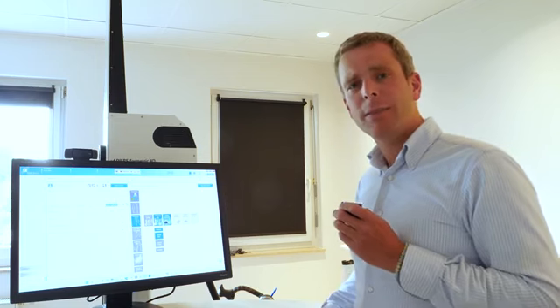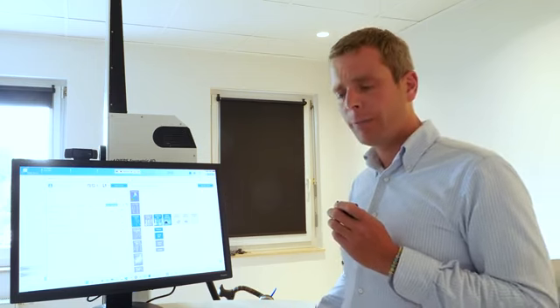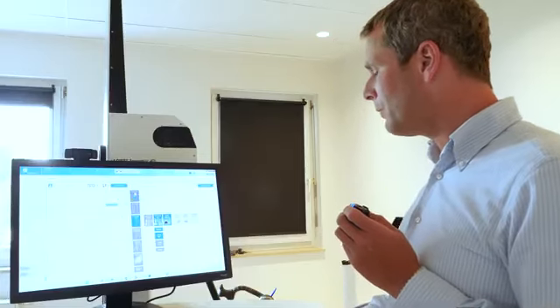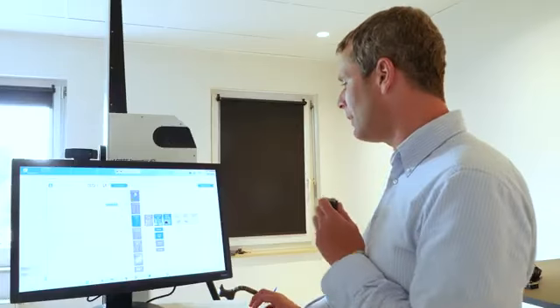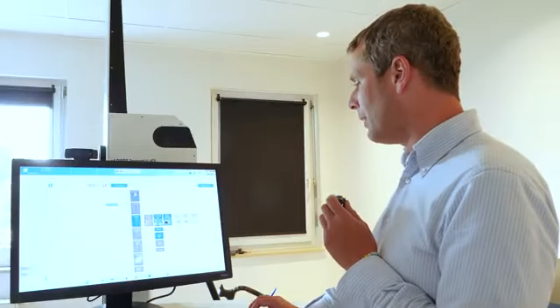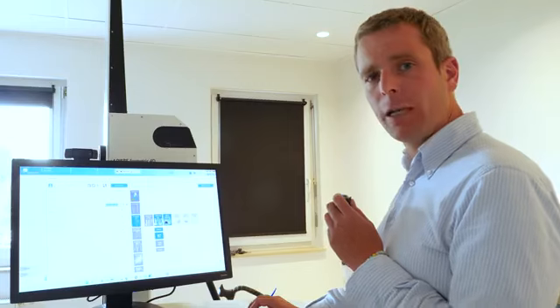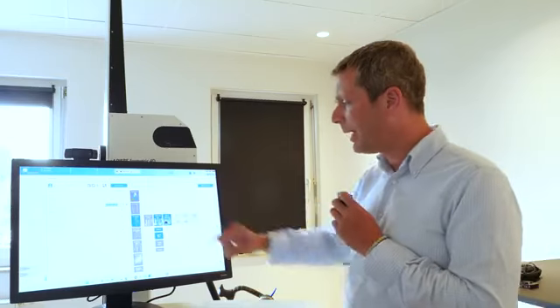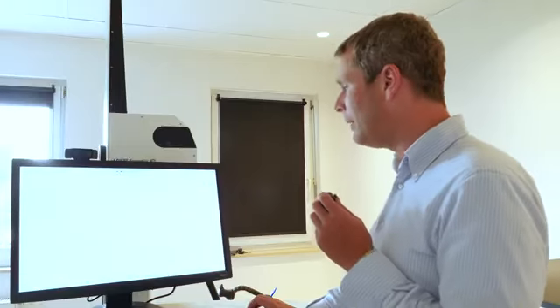Today, we want to show a practical example of how easy our systems are to use, especially in follow-up inspections. I now have a colleague of ours here who has a torn cruciate ligament in his right knee and is now more or less recovered. We still want to check for a protective posture. For that, we decided to simply perform a leg axis analysis using only the treadmill. In this case, we leave the spine out of it, then simply start our DIERS software here.